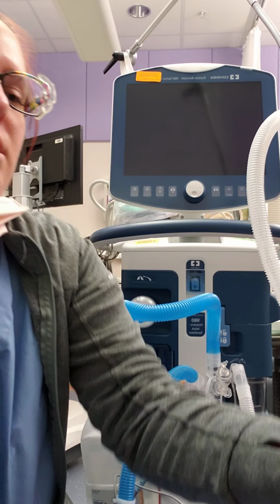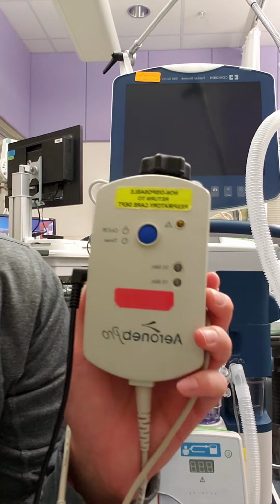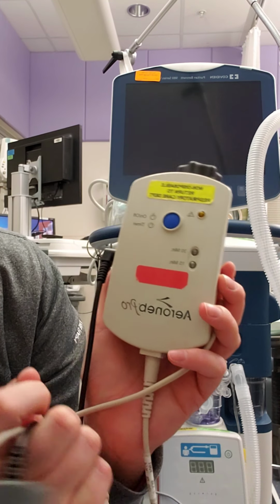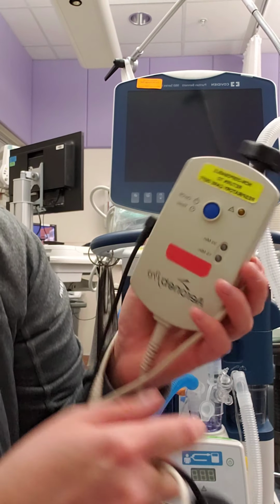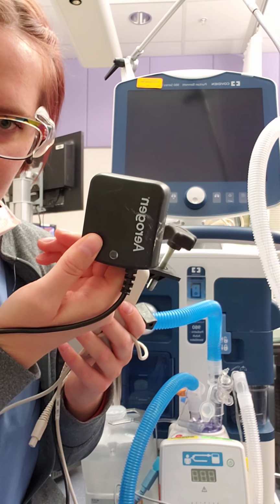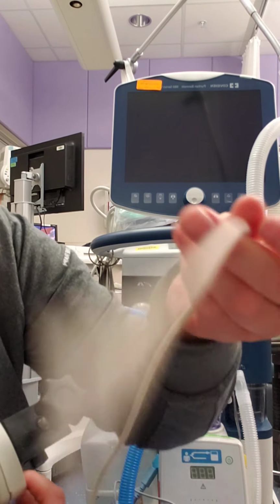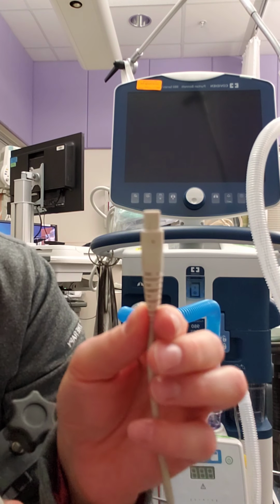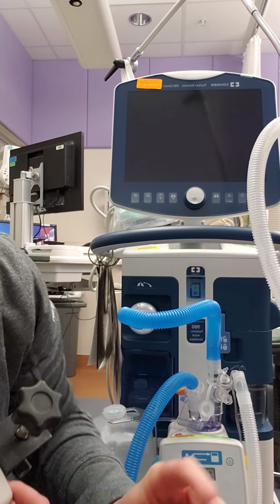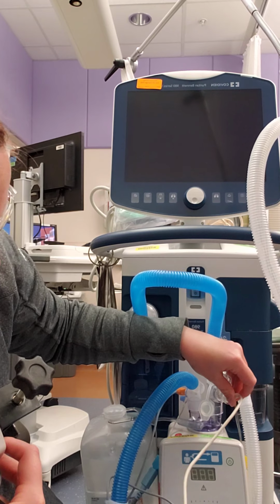The Aerogen cannot run without this little adapter, and a lot of the time you'll also hear it called an Aeroneb or Aerogen. How it works is one piece connects to electricity, the other has this little adapter like this. That goes right in this little box on the Aerogen.